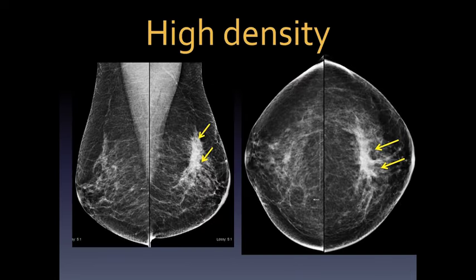Linear distribution follows grouped, where calcifications are arrayed in a line and associated with malignancy much more frequently — 68 to 70% of the time. Here are fine pleomorphic calcifications with a few coarse heterogeneous calcifications — not linear by morphology — but when you look at the distribution, they configure along a linear pattern. This should raise strong concerns for malignancy, assigned BI-RADS category 4C. These turned out to be DCIS of intermediate nuclear grade.